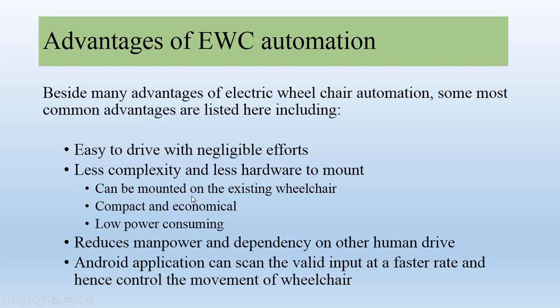This hardware can be mounted on the existing wheelchair, which is compact and economical and low power consuming. Similarly, reduces manpower and dependency on the human drive. Android application can scan the valid input at a faster rate and hence control the movement of electric wheelchair.